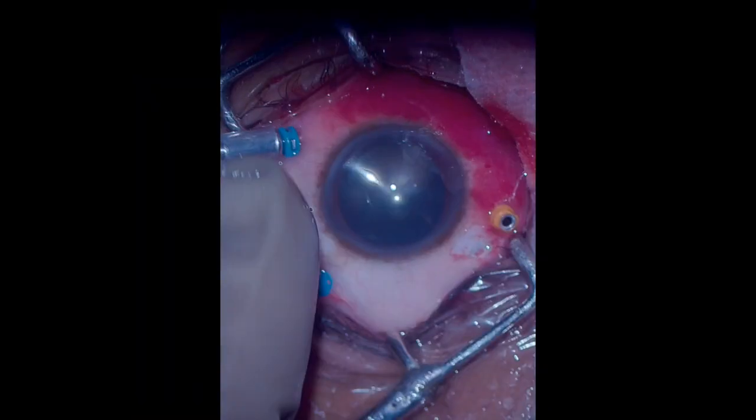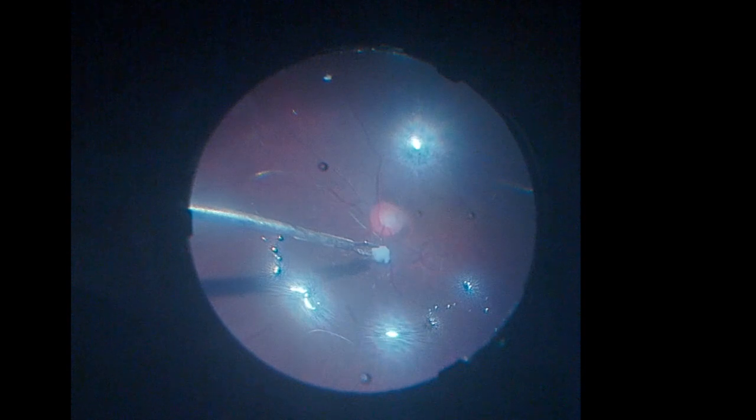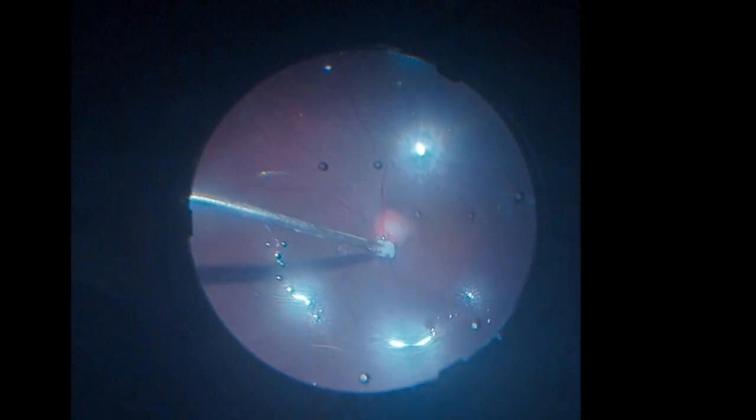Fluid air exchange was done. And before injection of gas, the position of the graft was confirmed. At this point, it was noted that the graft was displaced. So we used a forceps to place it in position, and then the light pipe was also used for the same.